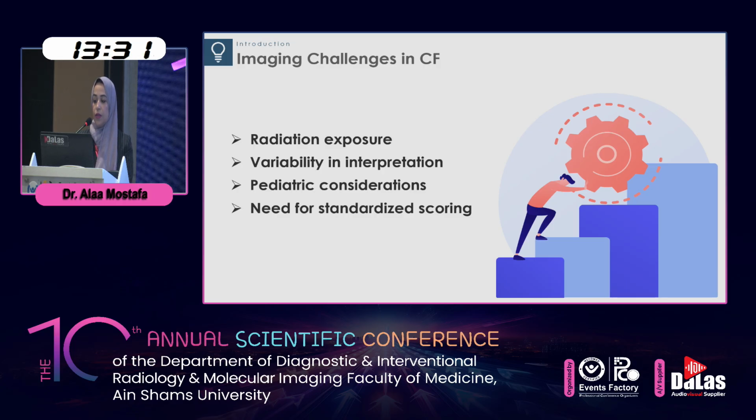Imaging challenges in cystic fibrosis include radiation exposure, variability in interpretation, and the need for pediatric-friendly protocols. Standardized scoring systems help address these issues.